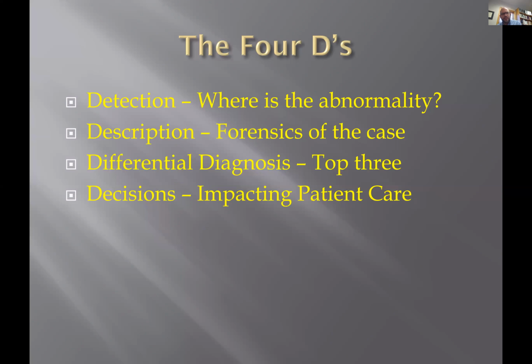But after you detect it, it's real tempting just to slam dunk it and try to figure out exactly what it is and jump to your diagnosis. But if you slow down a little bit and just stop and say, I saw something, what am I seeing? What are the forensics? Exactly what am I seeing? Just description. Don't worry about not knowing what it is. Getting a careful description is, I think, very important for the practicing clinician, because you've got to determine if something is aggressive or non-aggressive. I mean, that's your job, to do that quickly. If it's non-aggressive, leave it alone. If it's aggressive, you need to ship it out.